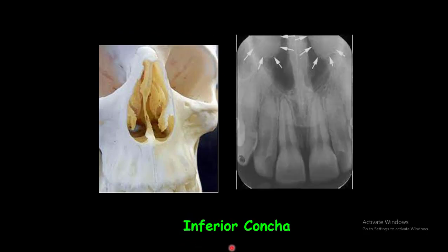The inferior concha. The lateral walls of the nasal aperture contain thin bony projections called the conchae. The conchae plus the mucosal covering are called the turbinates. On the periapical radiograph of the maxillary incisors, the inferior nasal concha is often visualized extending from the right and left lateral walls toward the septum.